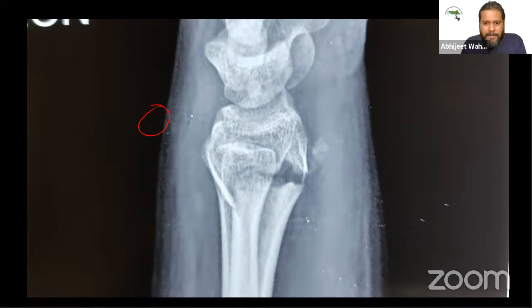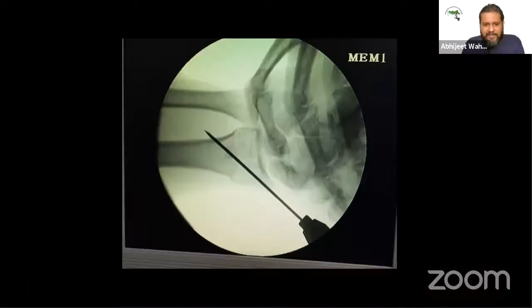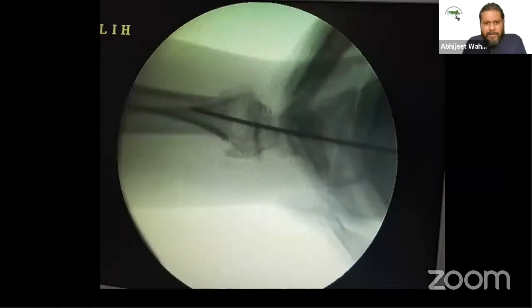Okay. Right. So just as a teaching point, we put in a K-wire to assess if K-wires would have been sufficient. And this was just to demonstrate that K-wires may not be sufficient. So here in the PA view, one might still be tempted to think that maybe K-wires would be sufficient. Looking at the PA view, the alignment looks reasonably good. And then we also got a lateral view, and lo and behold, the lateral view fails to reveal restoration of the normal parameters.